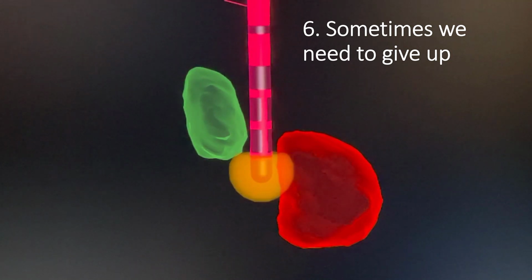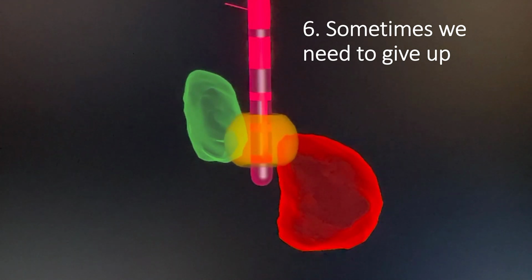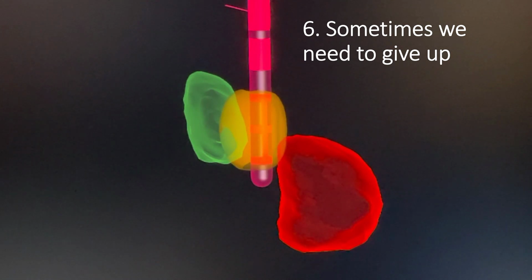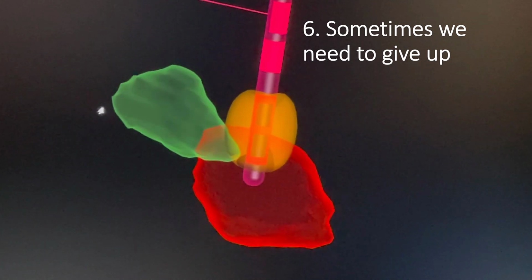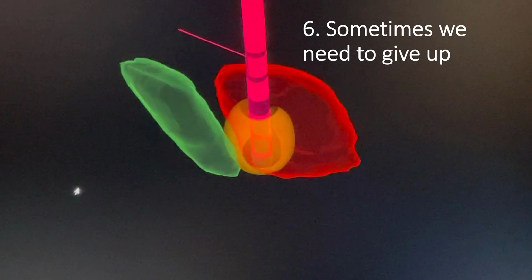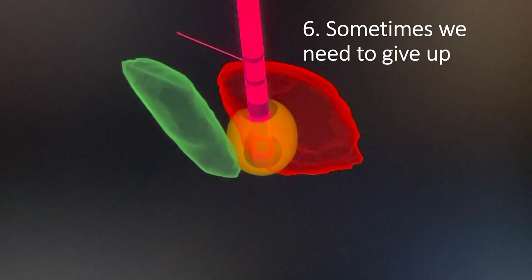I will now and then receive patients for second opinion where the referring center has spent years on trying to optimize the stimulation with little success, and where a quick glance at the location of the electrode is sufficient to decide that the electrode is so far away from the intended target that there is really no chance of a successful outcome. So, by looking at the location of the electrode, you might save yourself from many hours of futile and frustrating attempts.